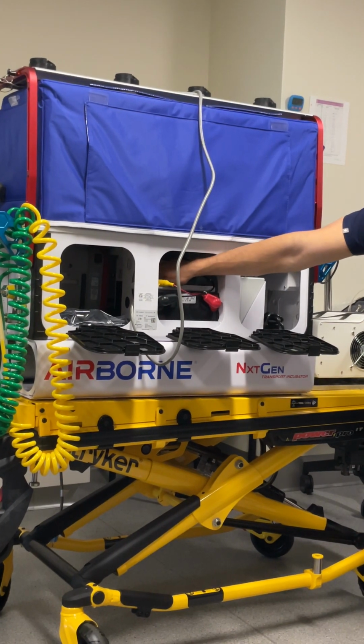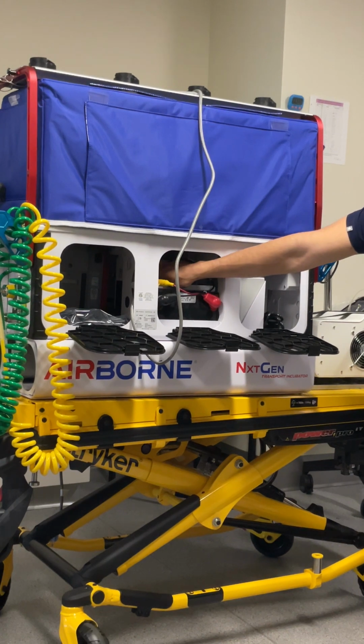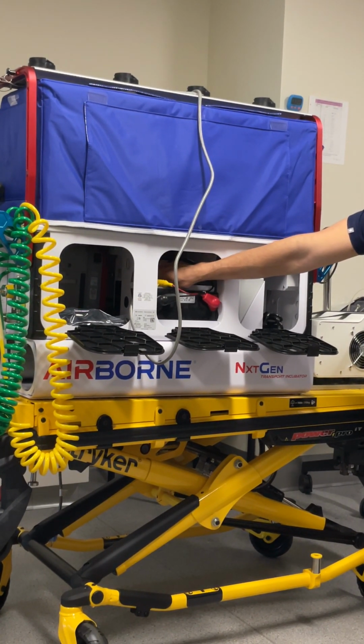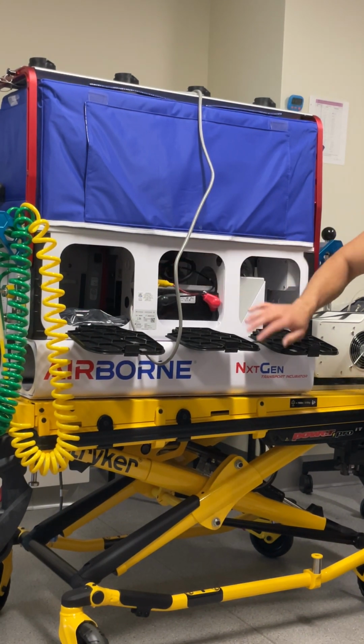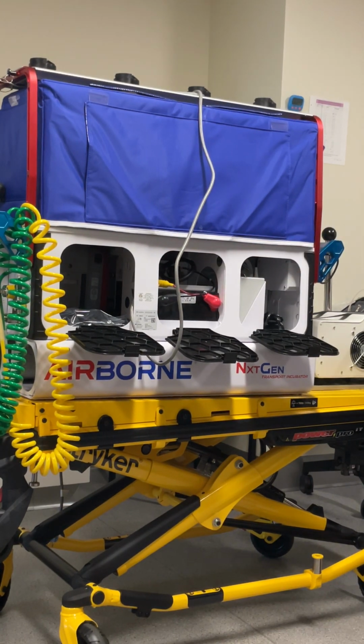This little red button is the oh no button. It's like a hard reset of the computer. So if you turn it on and something hasn't, you don't understand why it's not doing what it's supposed to do, you press the button to hard reset it. It's the red one back there? Yep, it's that big red one in the top left corner. You shouldn't have to ever use it, I hope. So far, none of mine have, and I've had this out for 2.5 years.